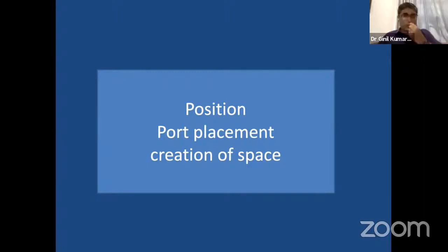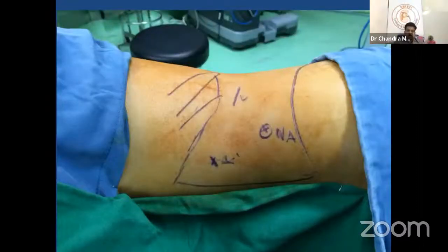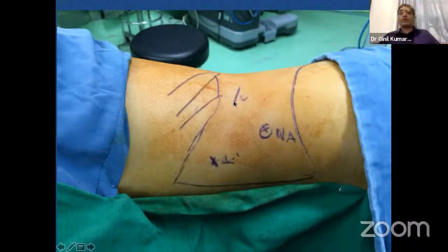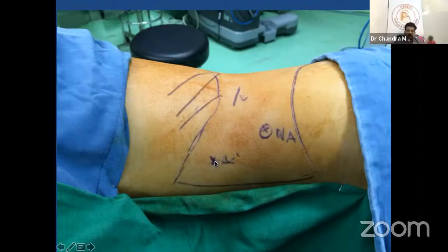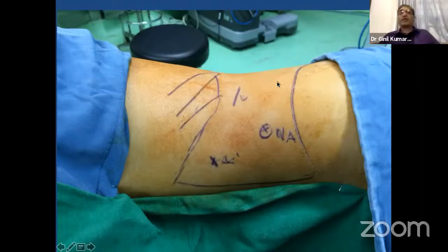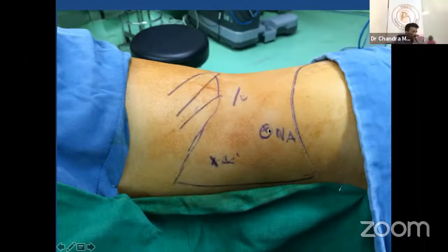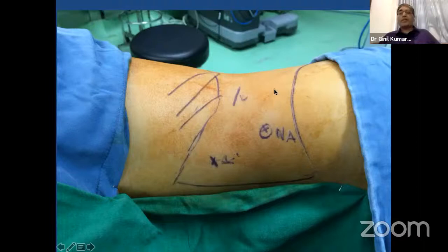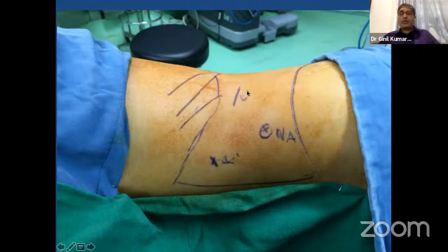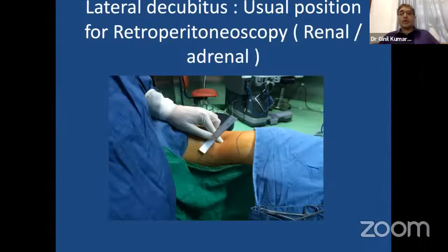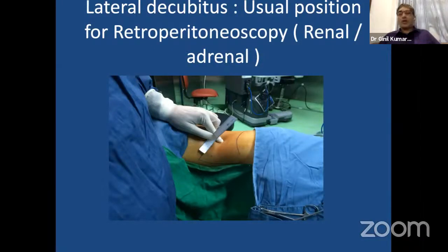With this introduction I'll go to retroperitoneoscopic adrenalectomy. First is port placement and creation of space. I usually put the camera port just below the 12th rib tip. The posterior port is at the renal angle. The anterior port is just lateral to the lateral abdominal line, lateral to rectus abdominis. I used to select two or three spaces for extra ports. Earlier I used to go for the Petit triangle, but later I shifted to just above the anterior superior iliac spine. Another area for a retractor port is just subcostal after dissection.